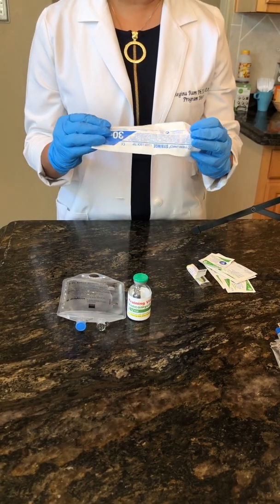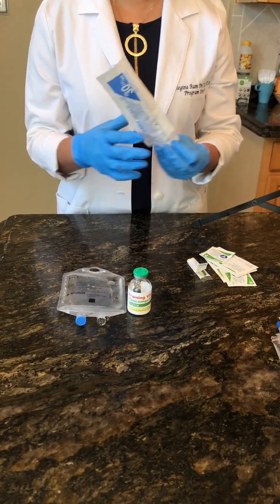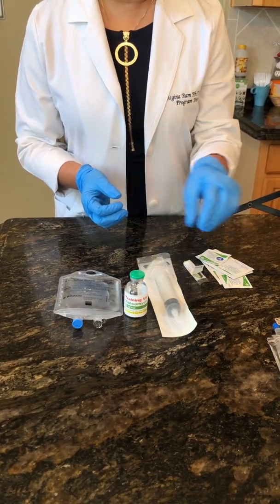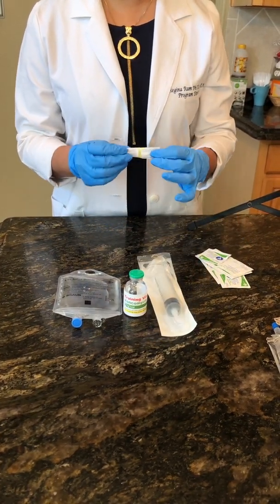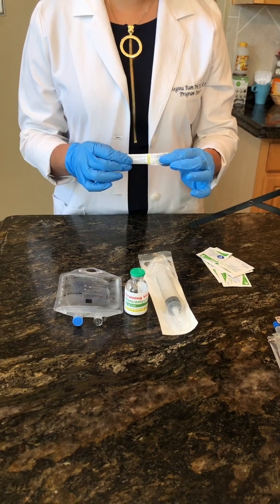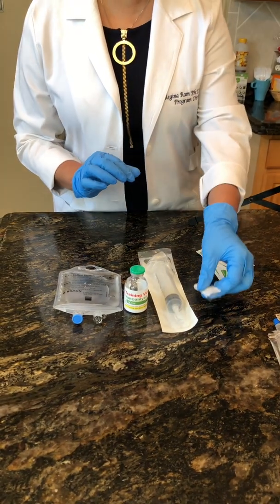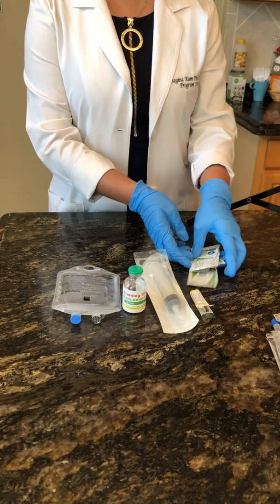You should have a syringe. I'm using a larger syringe today, but if you need to simulate with a smaller syringe, that's okay. I have a needle here, but if you don't have a needle, you will just simulate this video. And some alcohol prep pads.